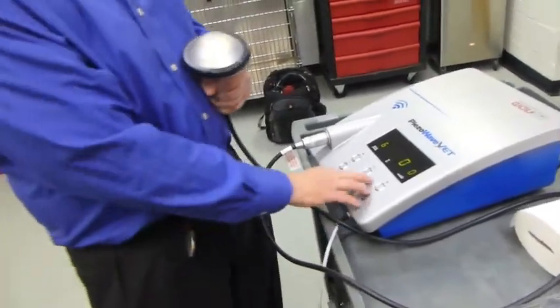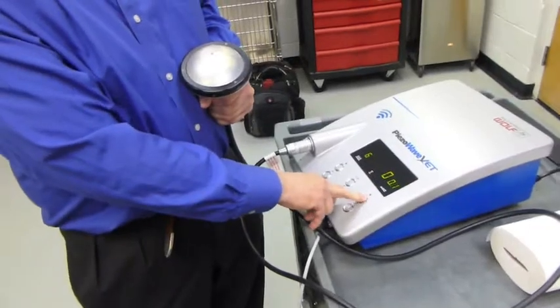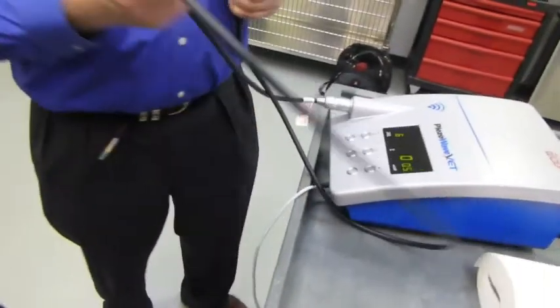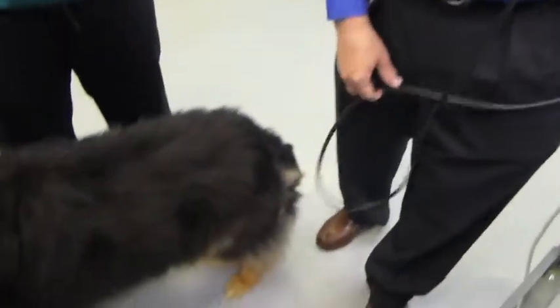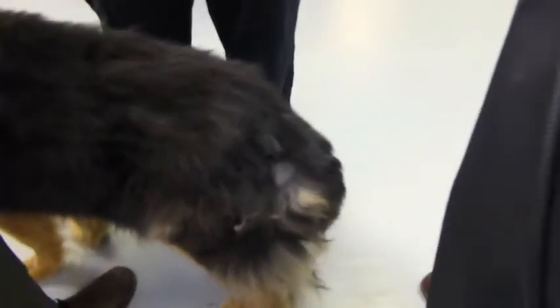For him, we have no idea what to expect, so we're going to start at 0.5. What we'll do is gel is cheap, really, relatively — we want to just use tons of gel.